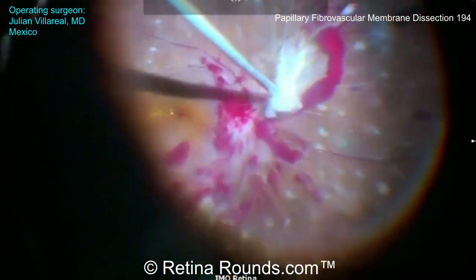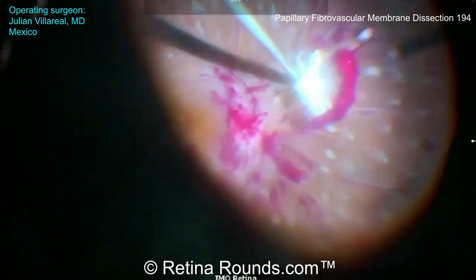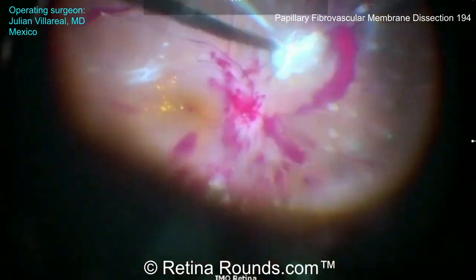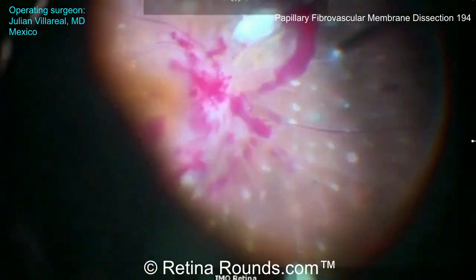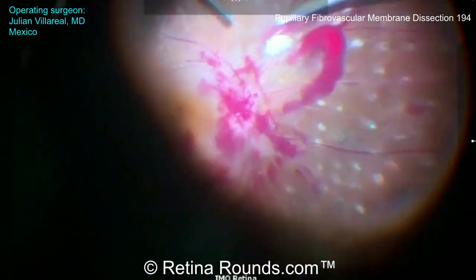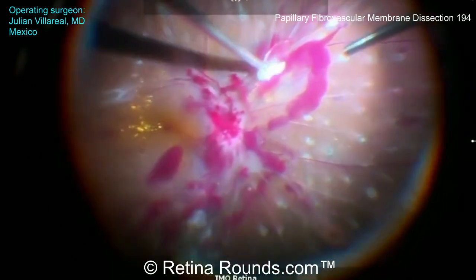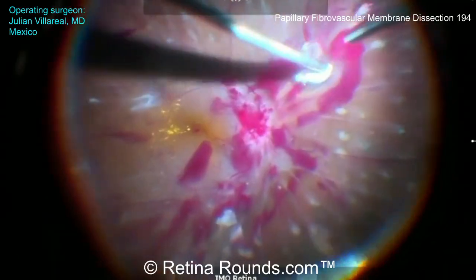At this point, the membranes over the optic nerve have been successfully segmented and delaminated using the cutter, and now Dr. Villareal is moving on to delaminate some of the more peripheral fibrovascular membranes. Especially in this infranasal area, one could argue that some of these areas are not as visually critical, and so a risk-benefit analysis should be performed to decide how aggressively one wants to be when delaminating these more peripheral nasal membranes.